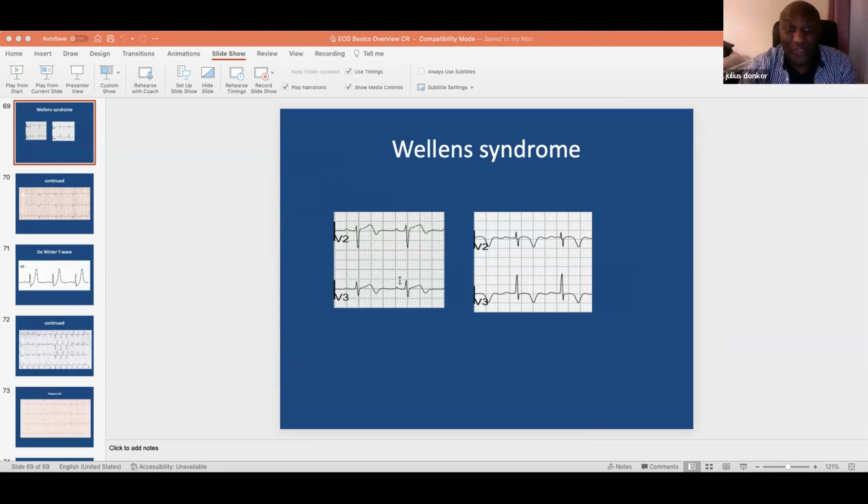So if you don't have that, even in the context of chest pain, then if the patient is African, suspect that it might not be MI. And the ST elevation, when you look at it, is not very convincing. So I'll show you what I mean by that. Life in the Fast Lane lets people use their website for educational purposes, so I can go on it and use it.